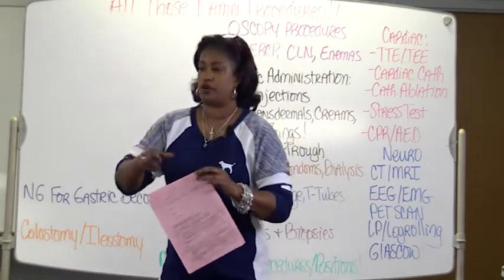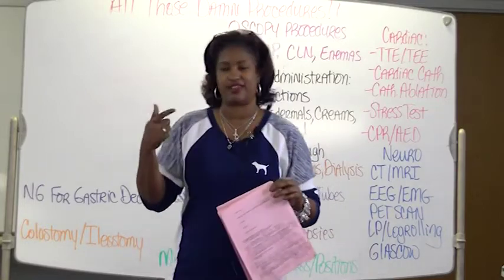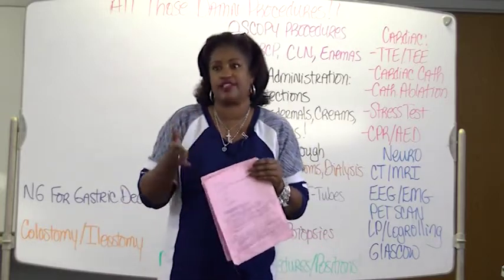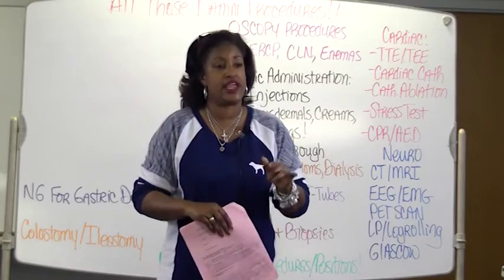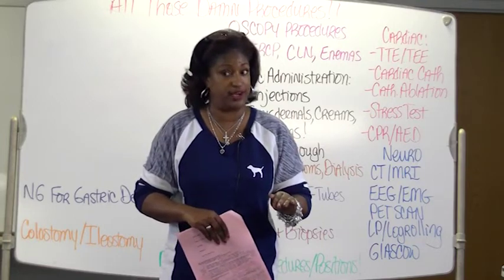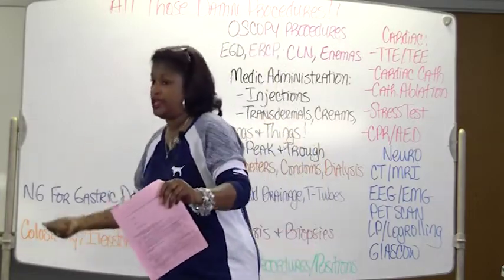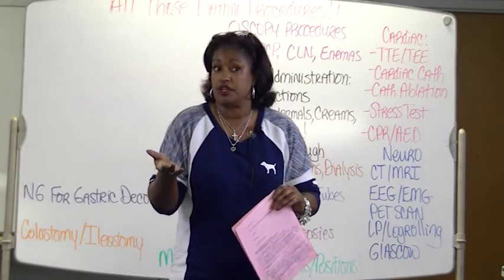Sadie said, remember, it's really long, and people don't really think that through. It's super duper long. So your patient has got to do a practice run before you pull it out, because your patient has to bear down the whole time you're pulling it out. And you can't just yank it. You've got to gradually pull it out. And so she does this practice run with her patient, which I think is a really good idea.